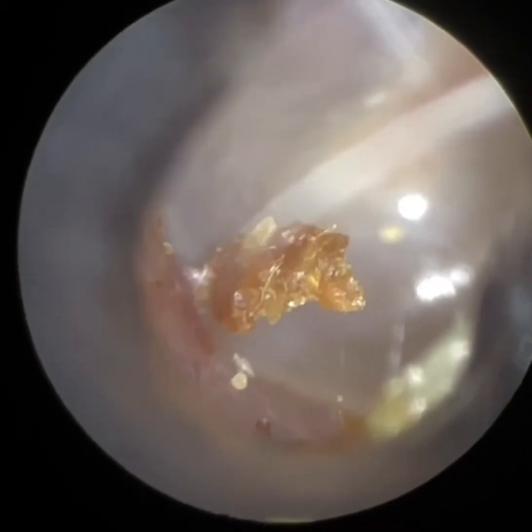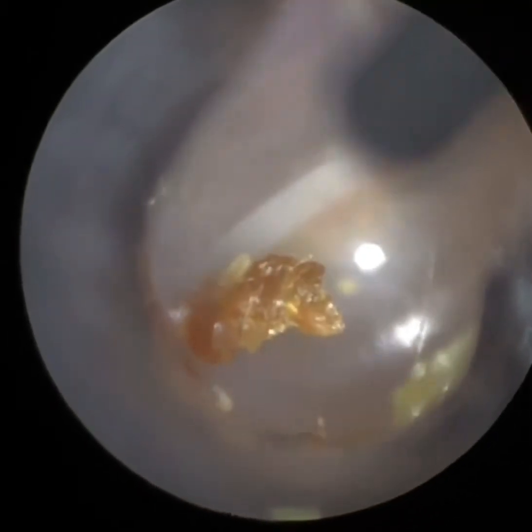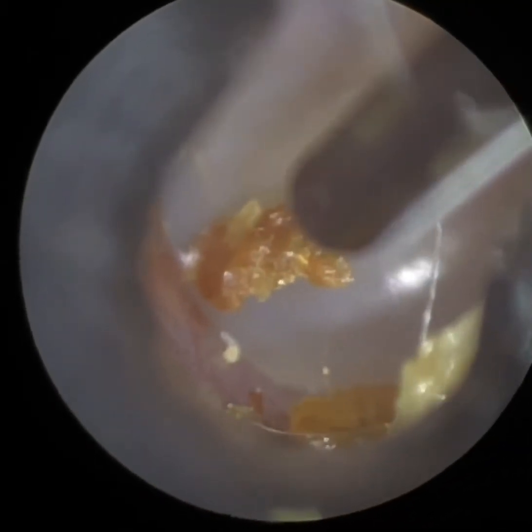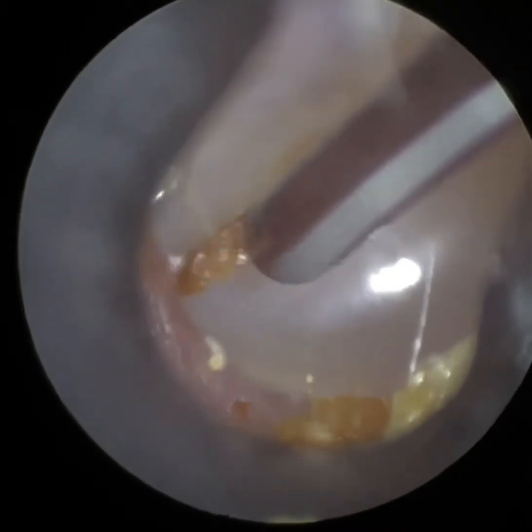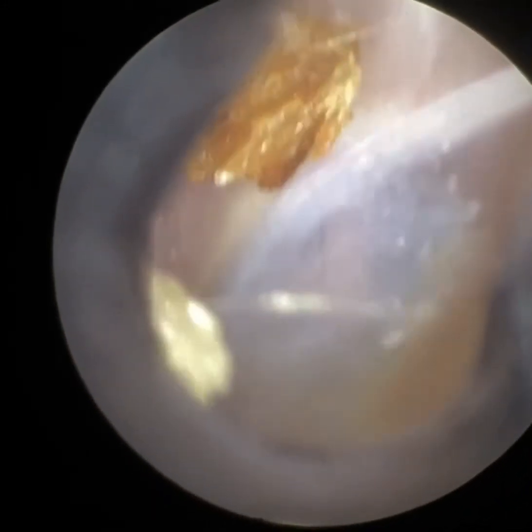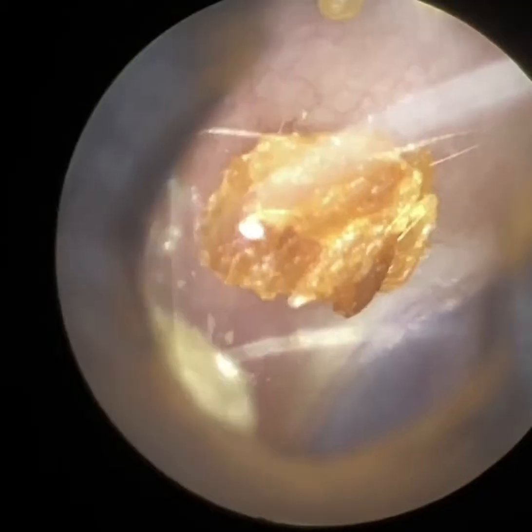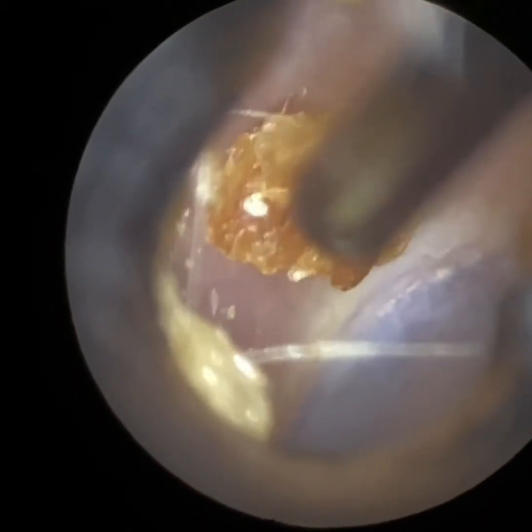It's just dilated the ear with our speculum. You can see at the top we've got a slit there, and that slit enables us to get more range of motion with an instrument. Also, because of that slit, we can insert the instrument at a high angle, which therefore doesn't obstruct the line of view with the lens of the camera and our Waxscope — so it doesn't become blurry. We can really see with precision what we're doing.